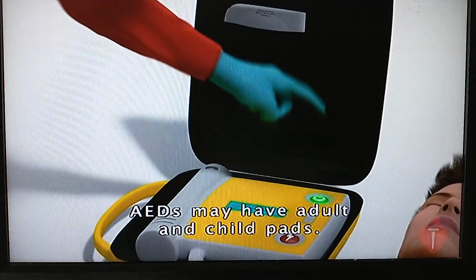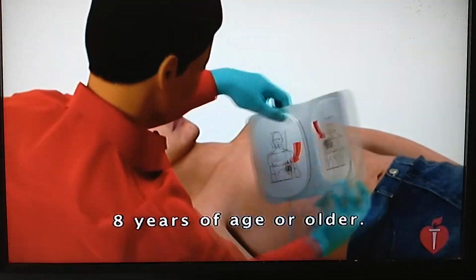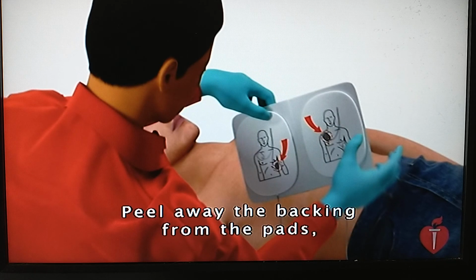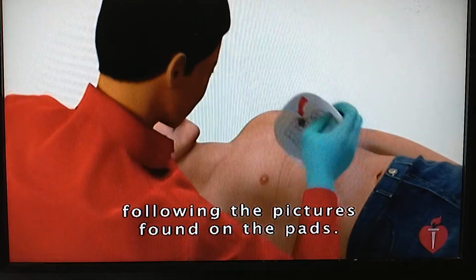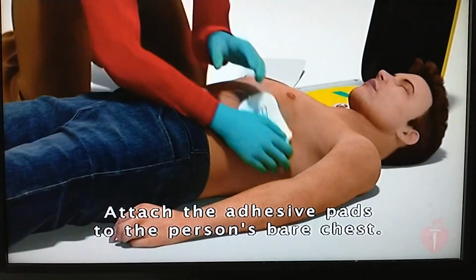AEDs may have adult and child pads. Make sure you use the adult pads on anyone 8 years of age or older. Peel away the backing from the pads, following the pictures found on the pads. Attach the adhesive pads to the person's bare chest.